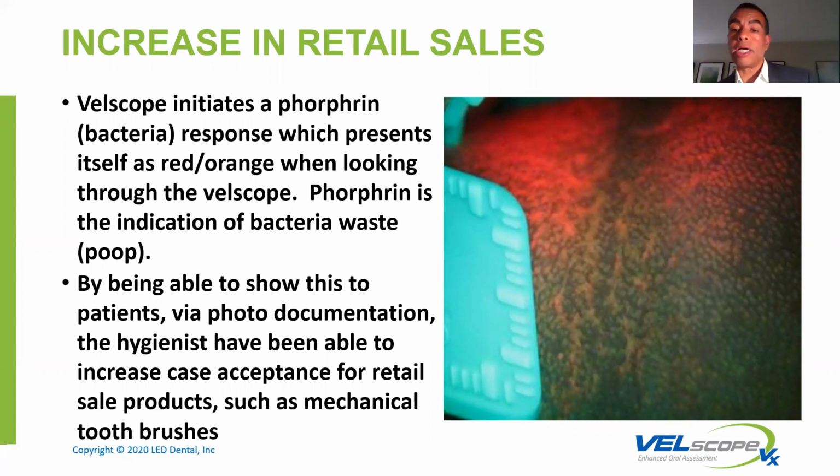But obviously, it's not just your tongue; it's also that bacteria in your gums, right? Which is obviously one of the things that we also recommend. So showing that picture, and I have to say, using the word poop really helps in relaying the message to that patient about the potential of the tools that you offer in terms of benefiting them when it comes to improved oral health.